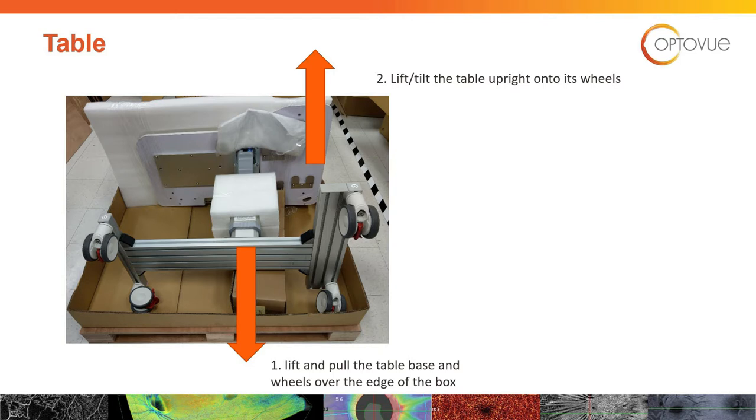To get the table out of the skid, lift the wheel portion over the lip of the box, pulling it towards you. Place the wheels on the ground and then tip the table upright.